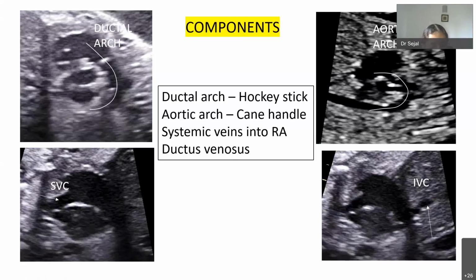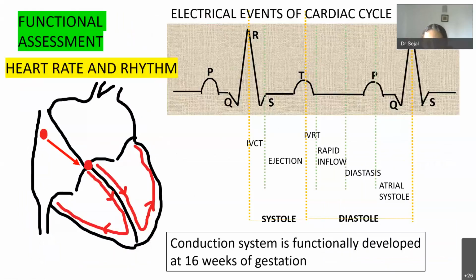Now, this was related to the structural analysis, structural understanding of the fetal heart. However, there is also a component of functional assessment. We will not go into the rhythm understanding in detail, but there are just 2 slides to have just an idea about what we are going to see in terms of rate and rhythm.